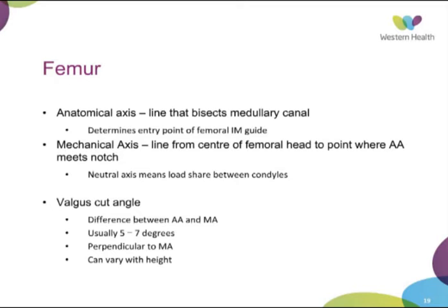And the femur also has a mechanical axis, which is a line from the center of the femoral head to the point where the anatomical axis intersects the notch. And having a neutral axis, as I mentioned before, shares the load between the condyles of the femur. And intraoperatively, the difference between the anatomical and mechanical axis determines our valgus cut angle of the distal femur.